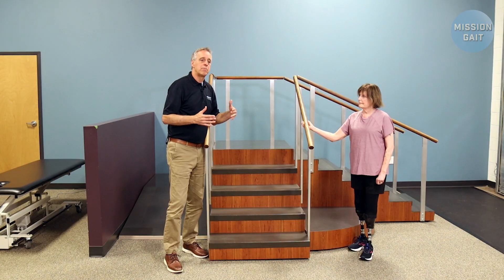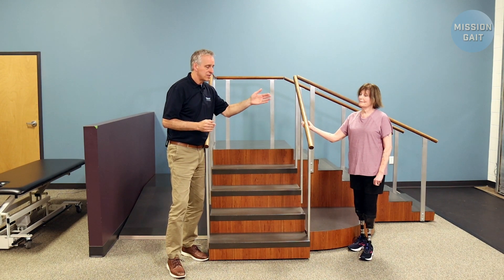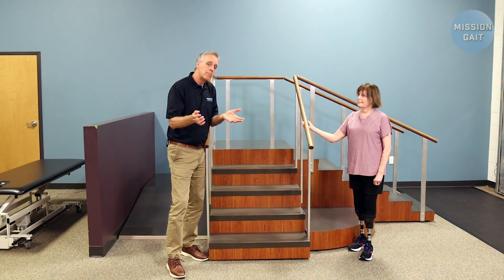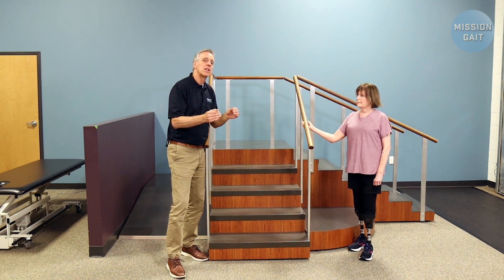The last thing we're going to look at is bilateral above the knee. We don't have that patient available today, so we're going to use Stephanie and have her help us by assuming those knees were fixed — because on an above-knee amputee going up and down steps, the knee is going to have to be fixed on the way up. And unless you have a microprocessor knee or a hydraulic knee, it'll have to be fixed on the way down too. So we're going to show you that, because that's the lowest level.